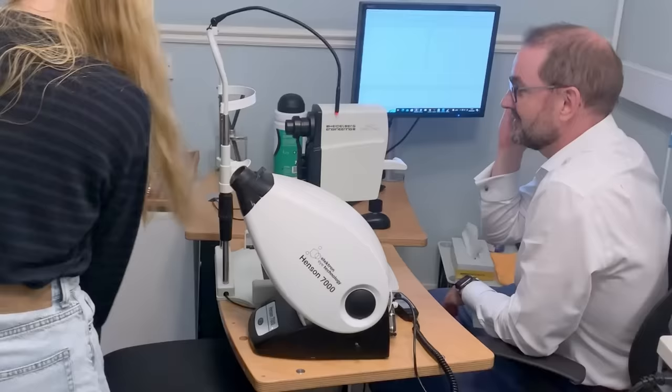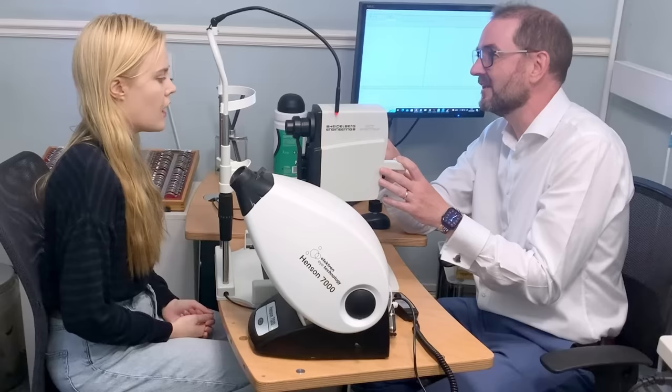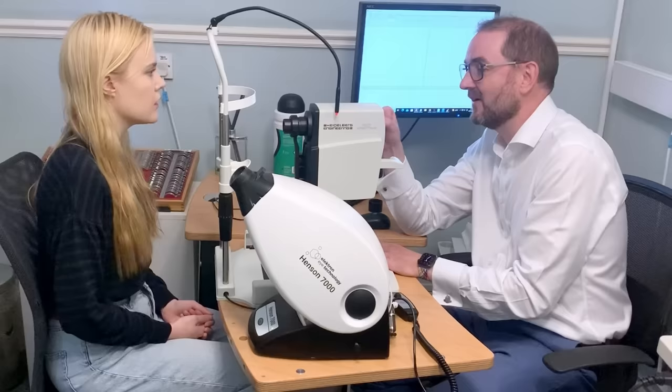This is the OCT. Have you had that done before? Do you know? I don't think I've had the OCT before, no. So OCT stands for optical coherence tomography. It's a bit of a mouthful, but it's basically mapping whatever it's taking a picture of. In this case, it's mapping your fundus, so the back of your eye, and your macula. I'll show you the images after I've done them.